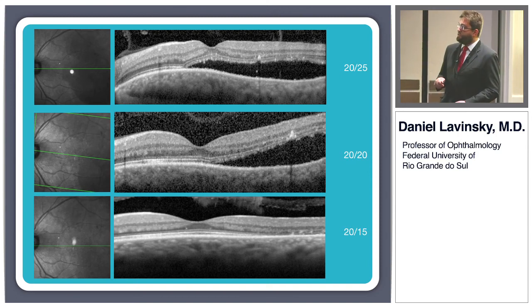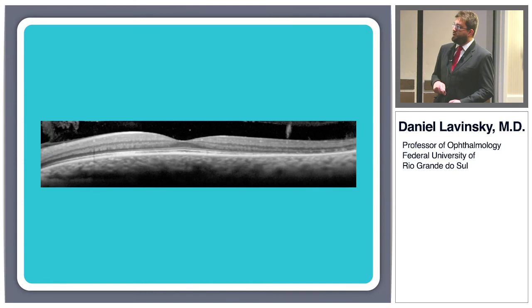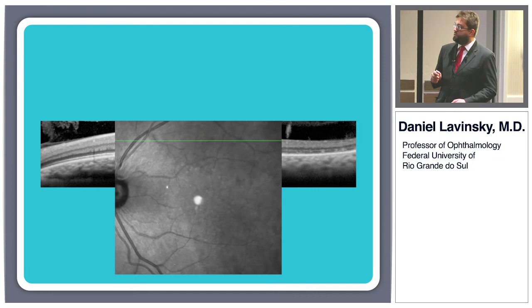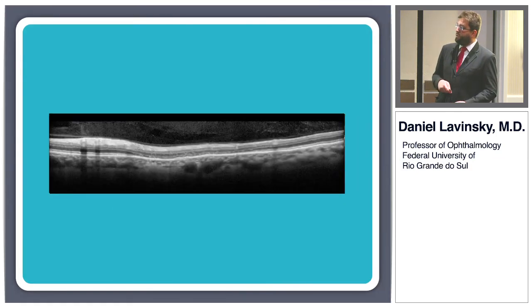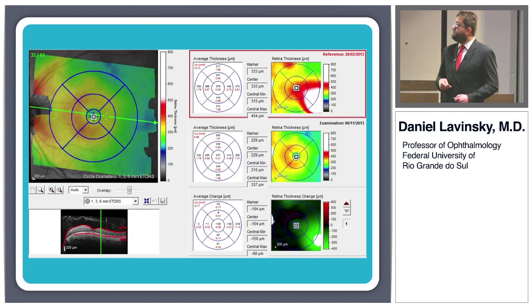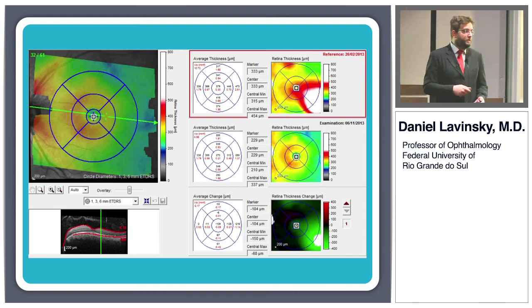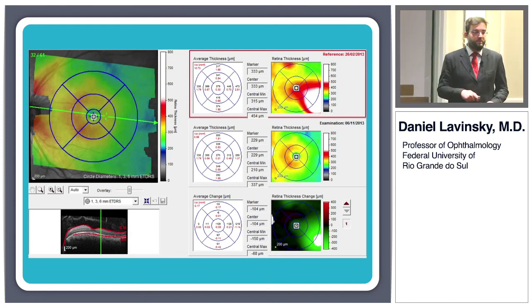But when we saw here where the area of leakage was, this did not respond in the first treatment, so we had to retreat. We retreated only this area here, and that's gone. So this is a complete resolution after 8 months. We have 8 months here with not only complete resolution, but stability from the treatment since the beginning.